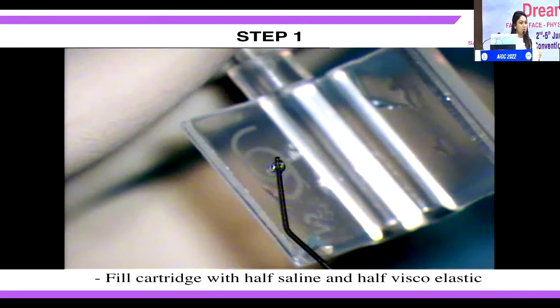So coming to the loading of the lens, the first thing is, whenever we are doing a phakic IOL, we are loading the lens first, rather than operating on the patient first. Why so? Of course, in IPCL, we have a backup lens, but it's always a good habit, because it's a premium surgery, with young patients. You don't want to make an incision and then load and see that you have a disturbed lens architecture. So it's always a good habit that you load the lens and then you start with the procedure.